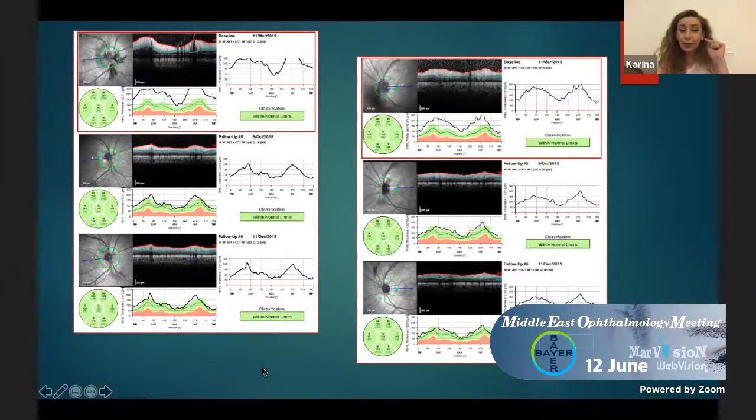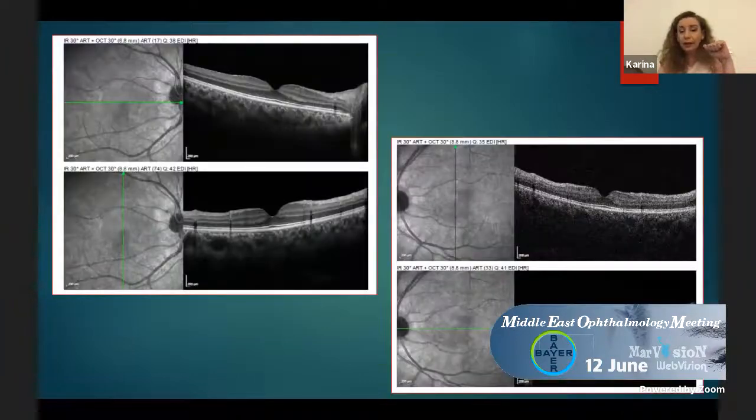And keep in mind that Behçet disease has central nervous system manifestations. So most probably these elevated discs were part of neuro-Behçet. We did for her MRI and everything, and there were no clear signs of neuro-Behçet, but this could be one of those signs. Macula, again, perfectly normal in both eyes. A very discrete epiretinal membrane here in the left eye, but her visual acuity is 20/20, and she's doing great, and we are just thinking about how to taper her systemic medication now.